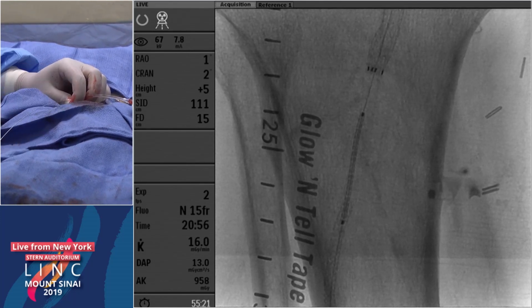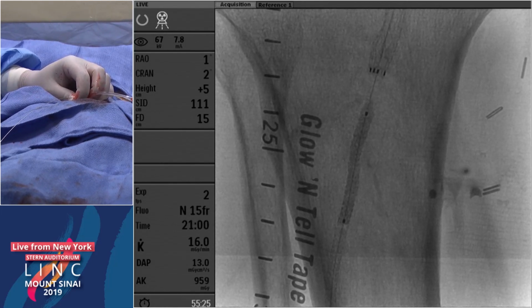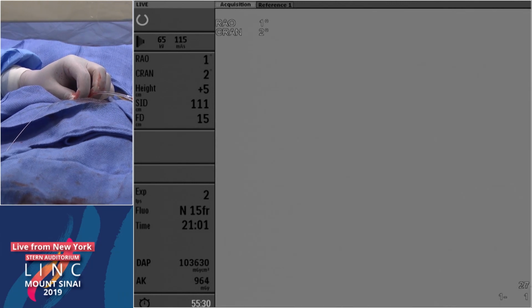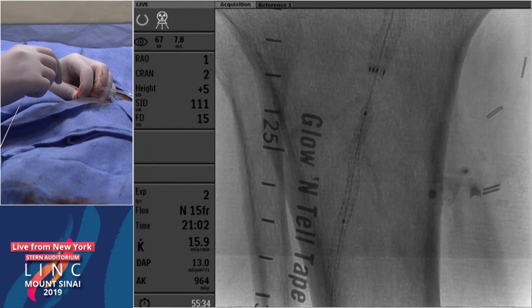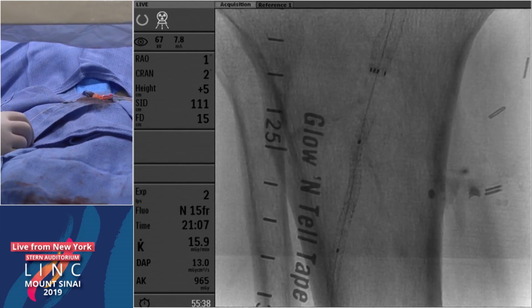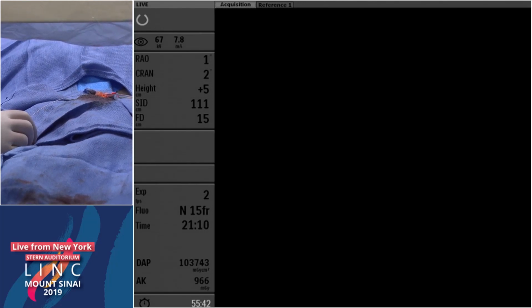So PK, I'm going to share the findings from Lutonix BTK, the 6 months outcomes. Let's have a discussion here. I think it's valid. Obviously the BTK drug-coated balloons are not available in the United States, but would any of our physicians use an off-label drug-coated balloon in this situation? Obviously the one that's available for us would be a 4.0. What do you guys think?